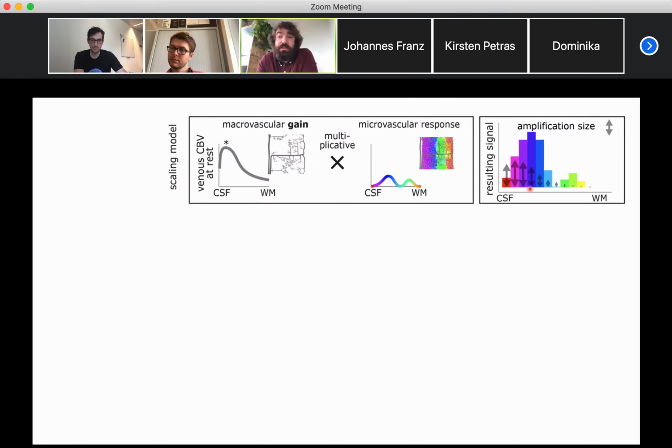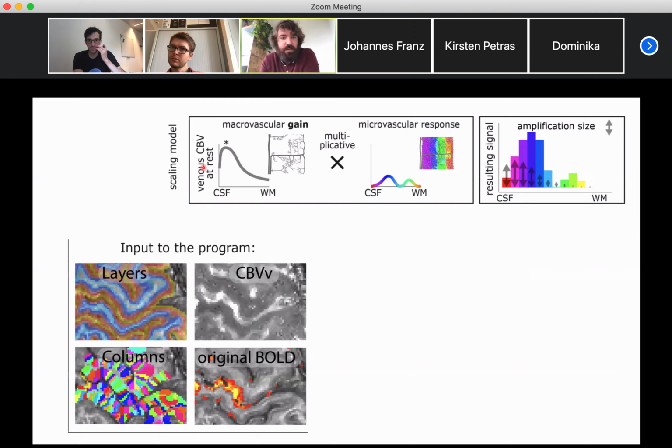To me, at least with the toy data, this one doesn't look as much like the toy data, but it does make a lot of sense to me, but it's a little more complicated. Or at least when I was reading about it, I thought I was going to have to collect more data. There was something additional I had to do, but if you read that blog post, you'll understand it's not too bad. So we've got 4 things to provide LayNii in this case.